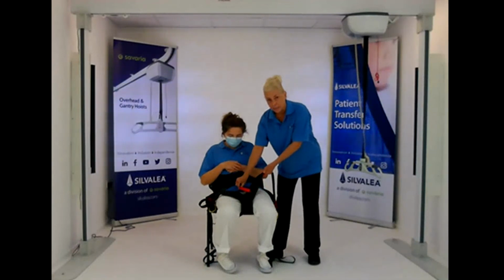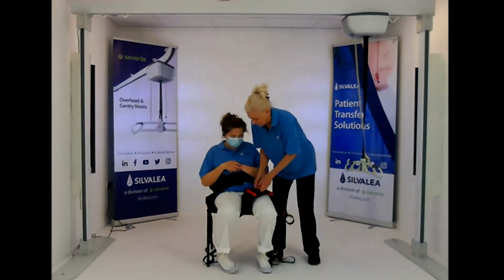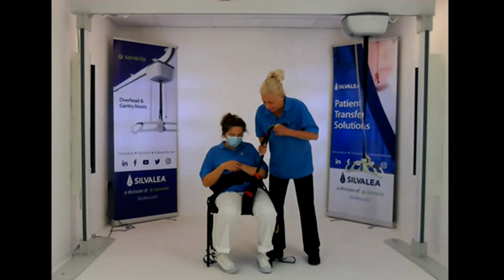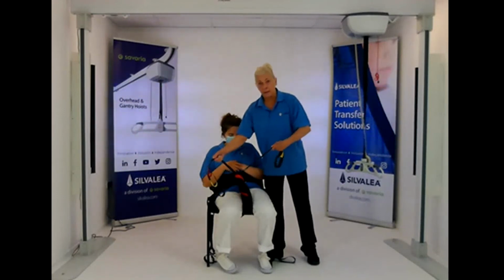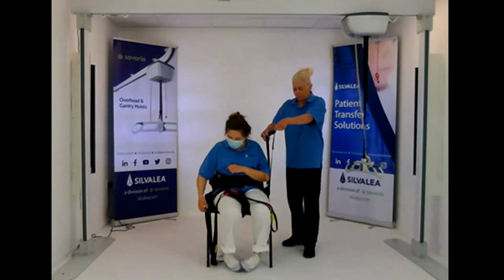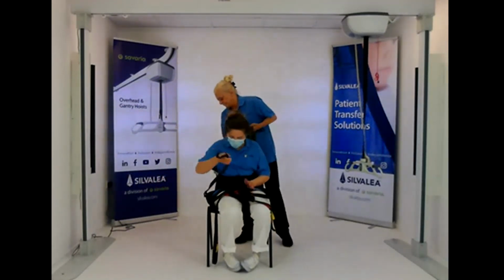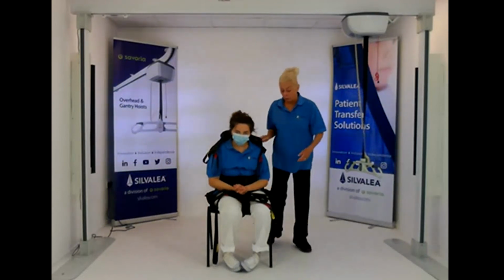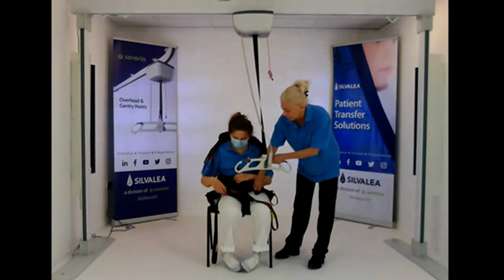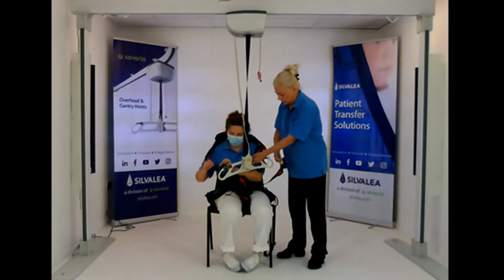here, we've got a modesty strap here and one there. So we're feeding one leg paddle through and then through the top. So we're doing everything we can to keep those legs together in that position there. There are two sets of hip tapes and there is a shoulder tape, a hip support tape. So lots going on. But if we build it from the bottom, so we're starting with the leg, we go on yellow, we keep it short.